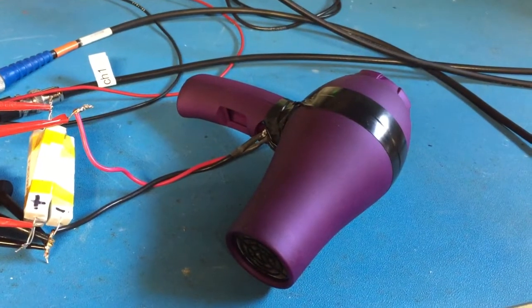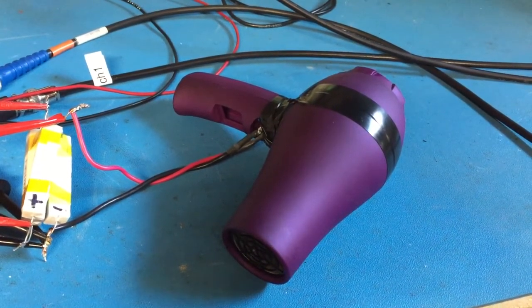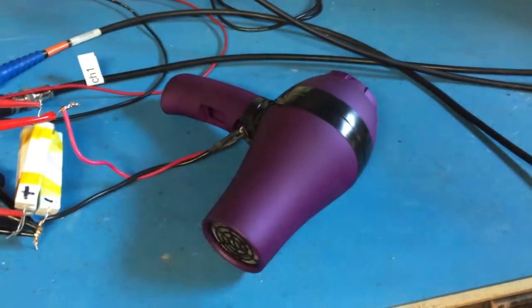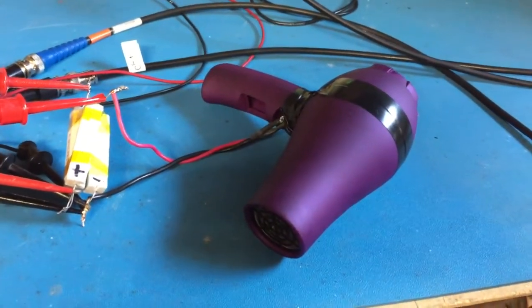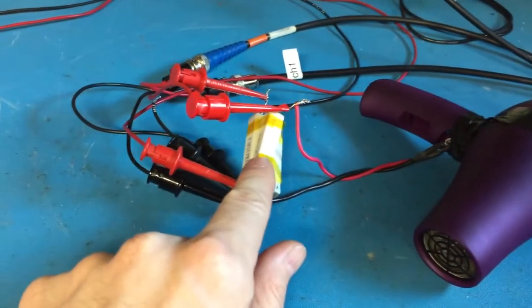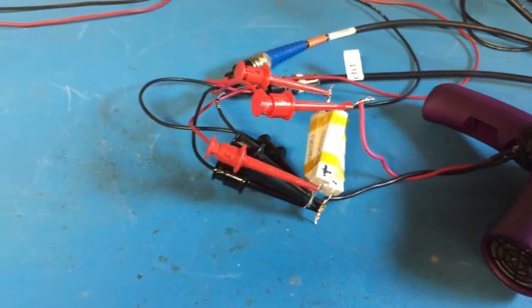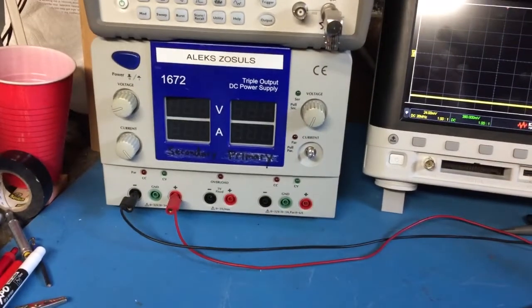We're back in the lab. So we have our hairdryer modified as a mass airflow sensor. When air or breath goes through the hairdryer, it causes a change in the internal resistance. So we use this Wheatstone bridge here to measure that resistance by voltage division. The Wheatstone bridge is powered by the bench power supply.